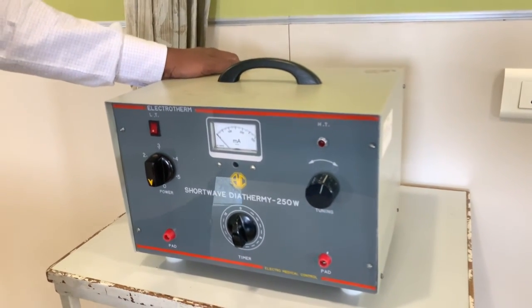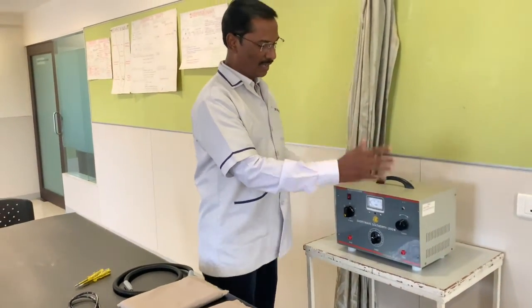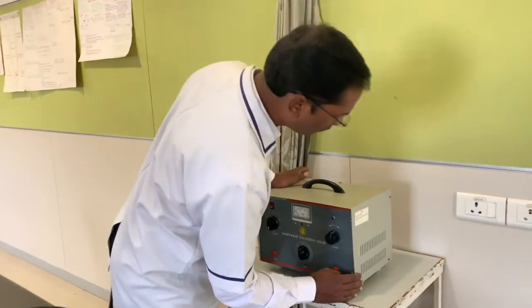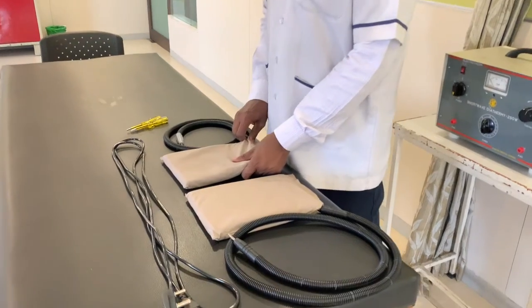Now we will continue with the testing of the apparatus. The first thing is physical examination. In the physical examination, I am checking for any damages in this apparatus. I am checking whether everything is intact. That is the first part. Second, checking the electrodes.